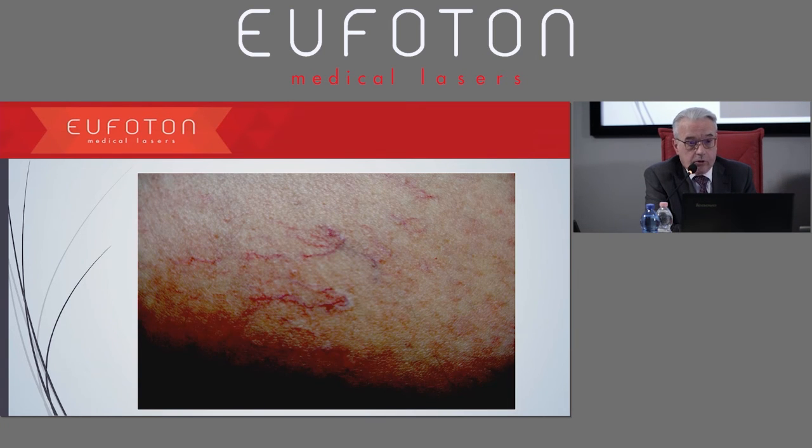So this is another result. It's not my work, it's a side effect. Here you see a patient who came to me after being treated with laser 808. You can see the white image of the laser beam, but also all the telangiectasias. So that means that they haven't been treated. We created a side effect, but on top of that, the photothermolysis was not there. And if you note, those telangiectasias are even more evident when compared to a normal one. So this is the laser effect.